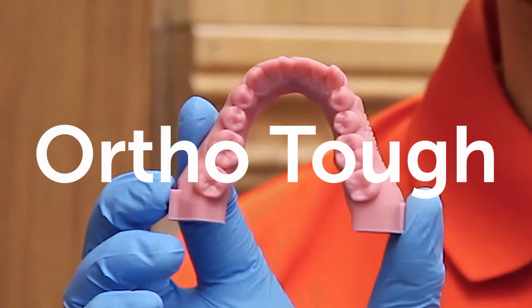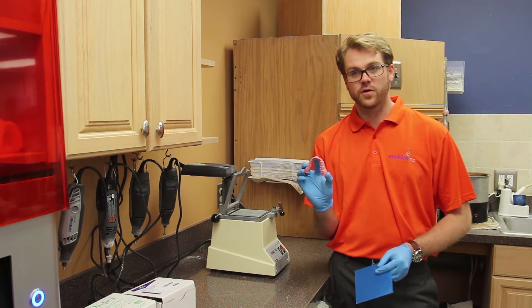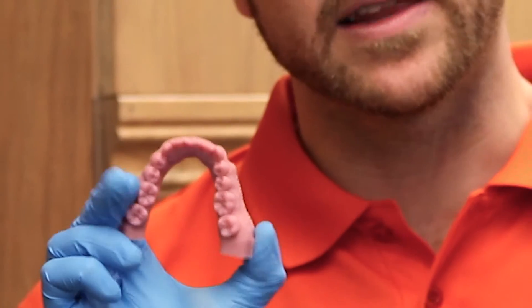So here's our Ortho Tough model that we just printed on the Vida. Ortho Tough, of course, is made specifically for the thermal forming process. It is very rigid, but it's also a little bit flexible, so it's got a little bit of give to it, so it holds its shape very nicely.